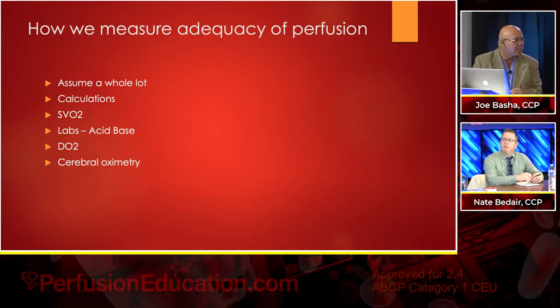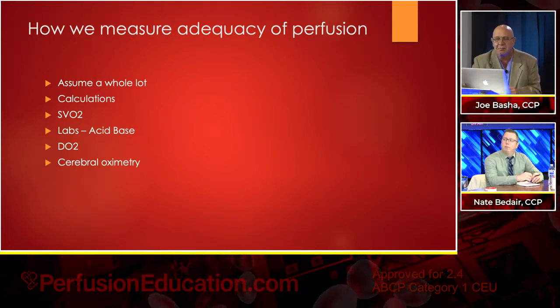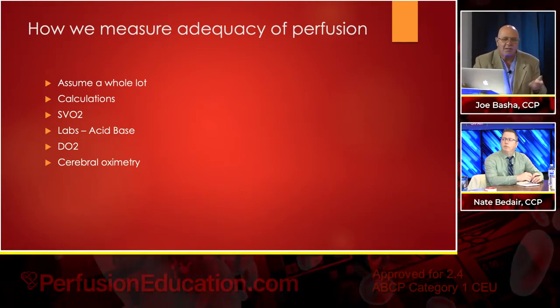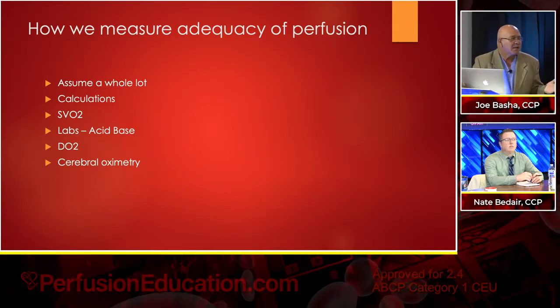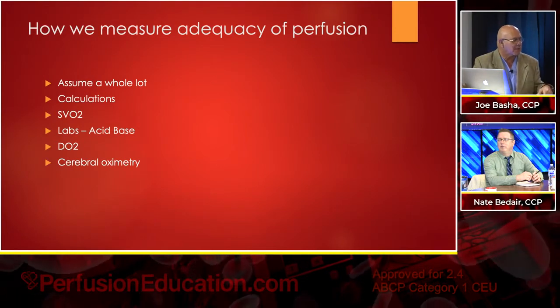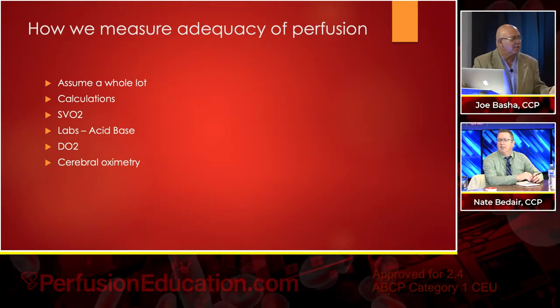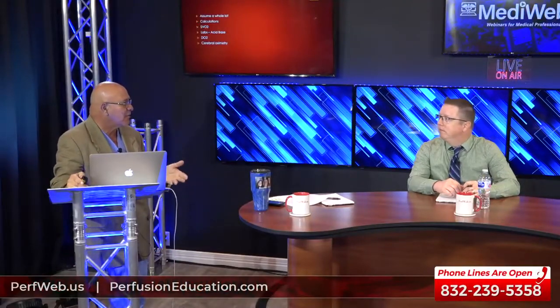Labs, we look at the acid-base balance. If they're not developing acidosis, then we're perfusing enough. But you can become acidotic through dilutional means. If you're using sodium chloride, you dilute out the bicarb, you become acidotic. That doesn't really mean you're not perfusing. If you're doing MUF on pump or CVVH on pump with replacement, and you're using sodium chloride, we've done it before to knock the potassium down. So you have a real high K. You ultrafiltrate off a liter, you give a liter of saline. Your bicarb plummets, you become really acidotic and you have to correct for that.